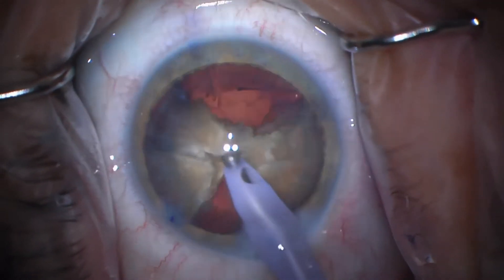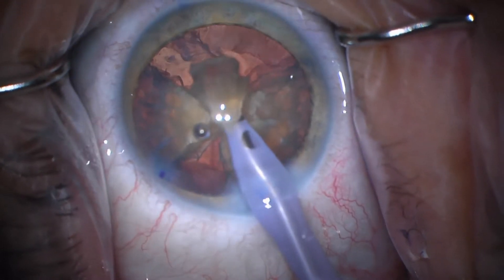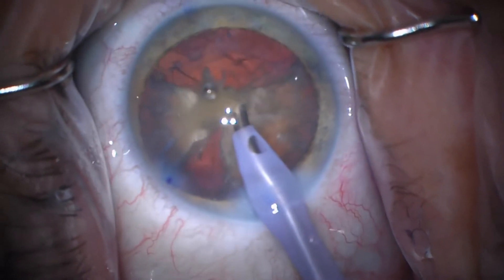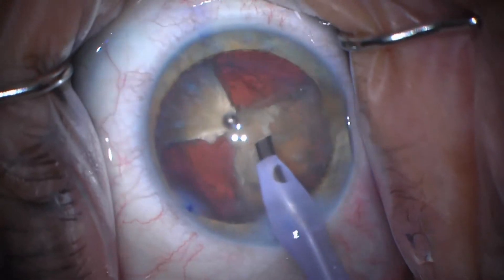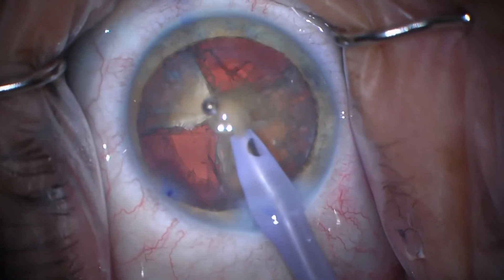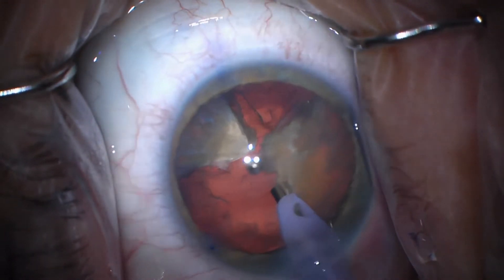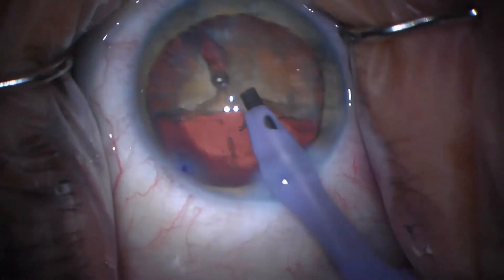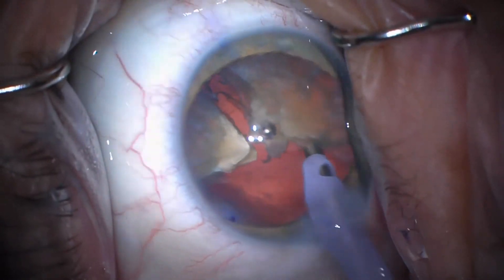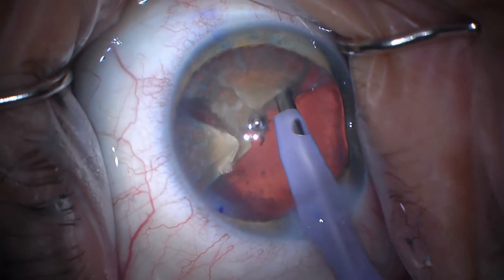We're not using a second instrument here because we have pretty good control of the chamber with the fluidics of this Centurion system. Adding the second instrument just in some ways makes things worse, which I'll show you a little bit later. So now all those three pieces just came in so nicely. I've got another piece which is sort of a more normal-size third, and it goes in fairly nicely too. For now I'm going to rotate around — I'm just going to leave that small piece to push the capsule back while I work on the big piece, which is a reasonable strategy.